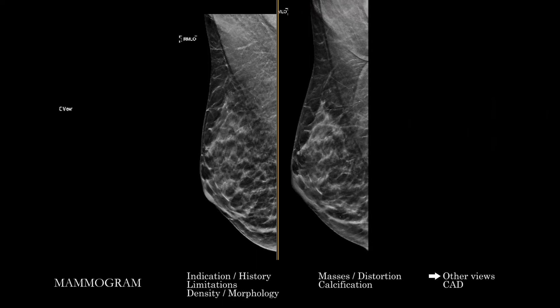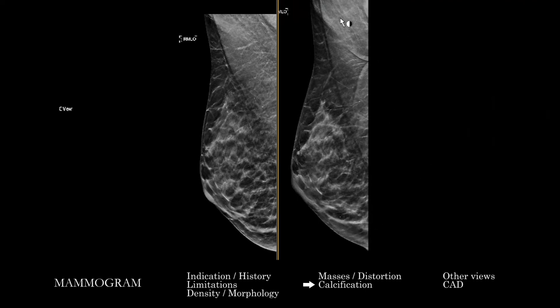Going through and looking at the 2D views and the tomosynthesis, you're looking for mass lesions, asymmetry, architectural distortion, and it can be particularly useful — especially on the tomosynthesis, whether conventional 2D views or synthesized 2D views from the tomographic images — to look specifically for calcifications, going through in a similar sort of search pattern.